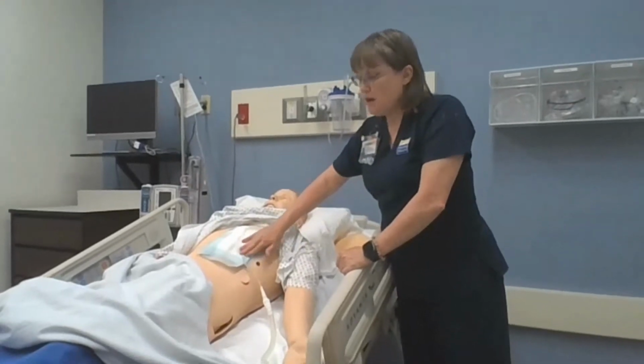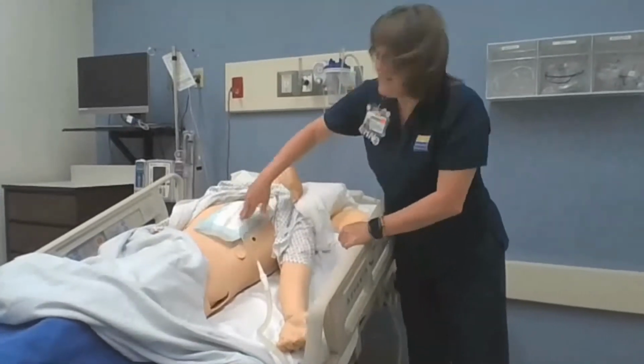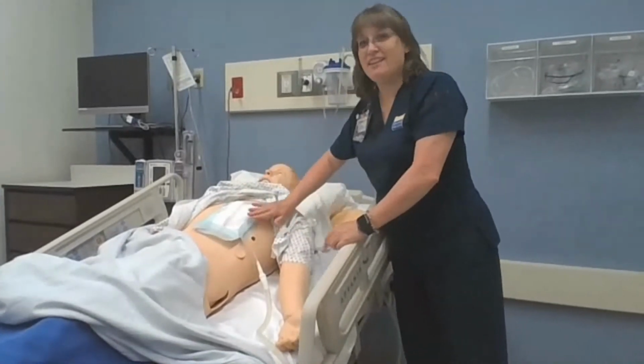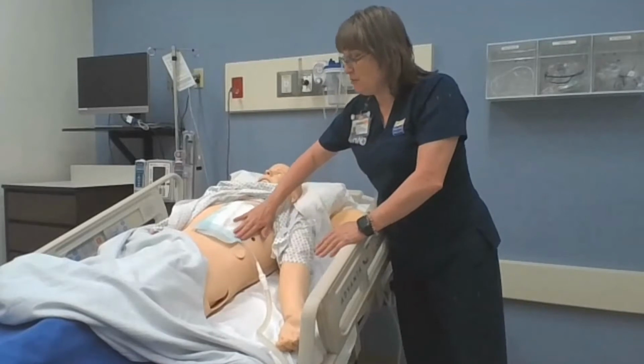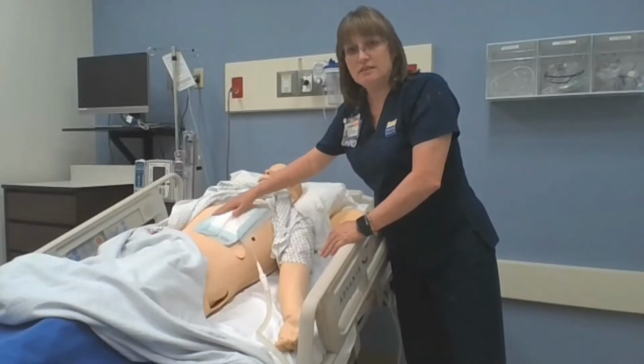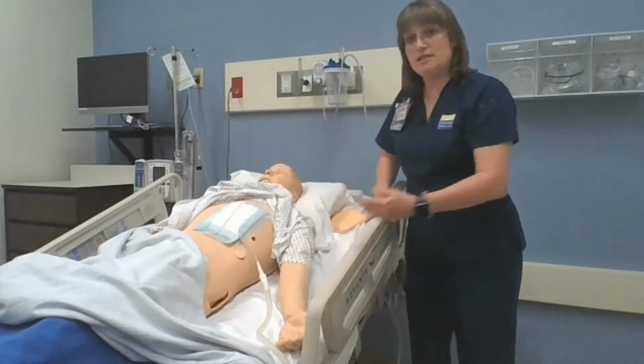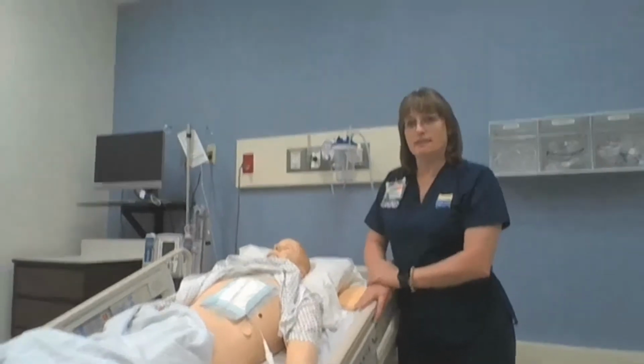Now, notice when I was palpating, I was not digging my fingers into the chest, trying to find out if they have subcutaneous emphysema. That's not what you do. You just lightly palpate, and yes, you can feel that subcutaneous emphysema underneath the skin. Now, subcutaneous emphysema means that there's air that's leaked in underneath the skin.